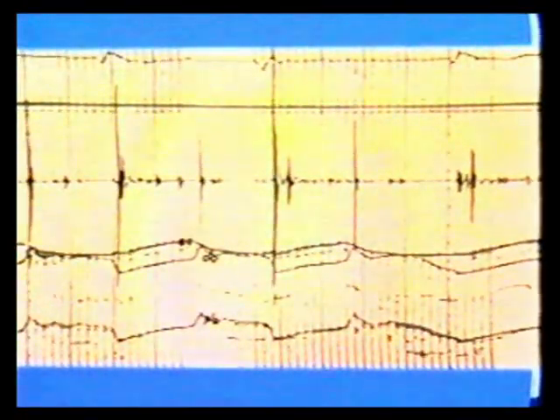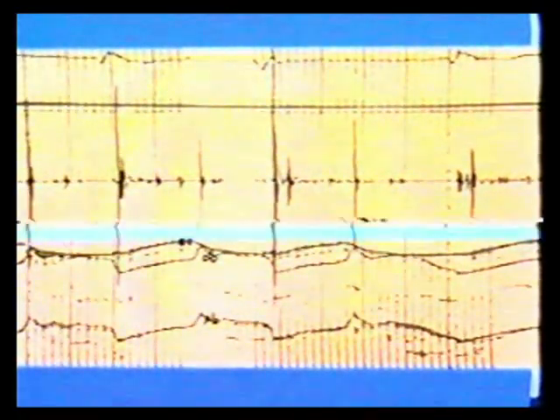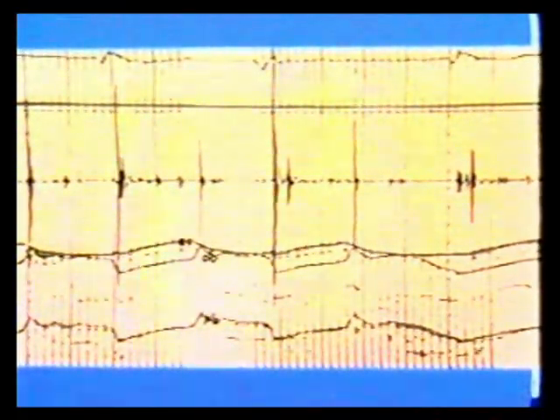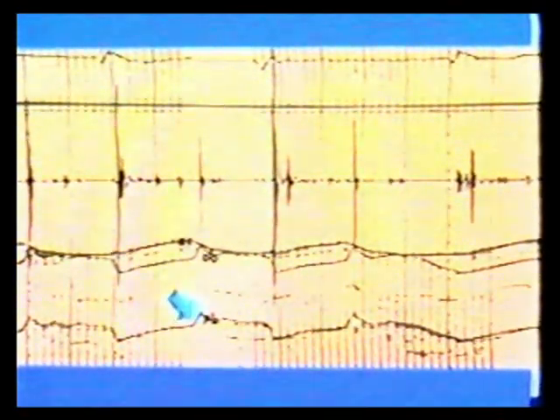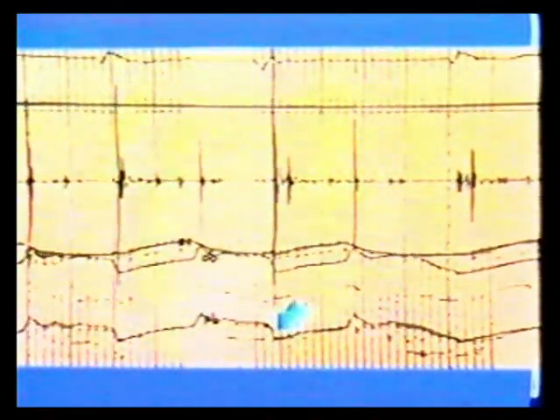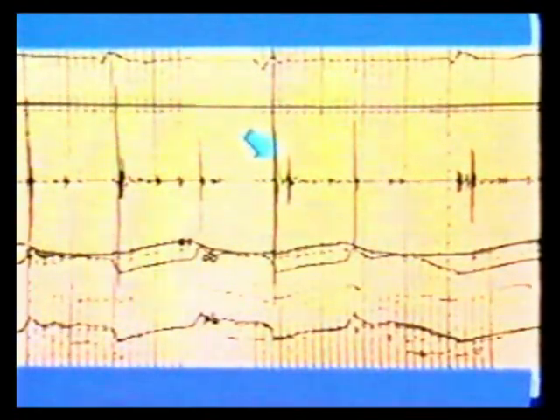Motion of prosthetic valves can be precisely analyzed using M-mode. This recording was made from an apical transducer position with a sound beam directed at a Starr-Edwards mitral prosthesis. This is the leading edge of the ball in systole, and this is the trailing edge. Here the ball is moving toward the apex to its open position, and here it is closing again with the next systole. Opening and closing clicks are recorded on the phonocardiogram.